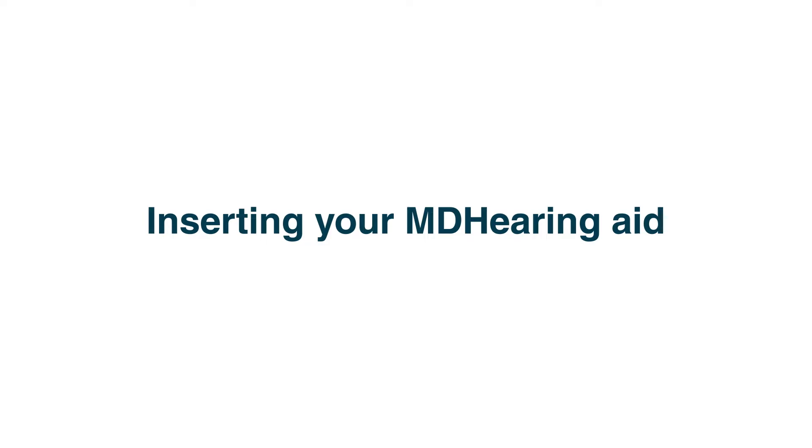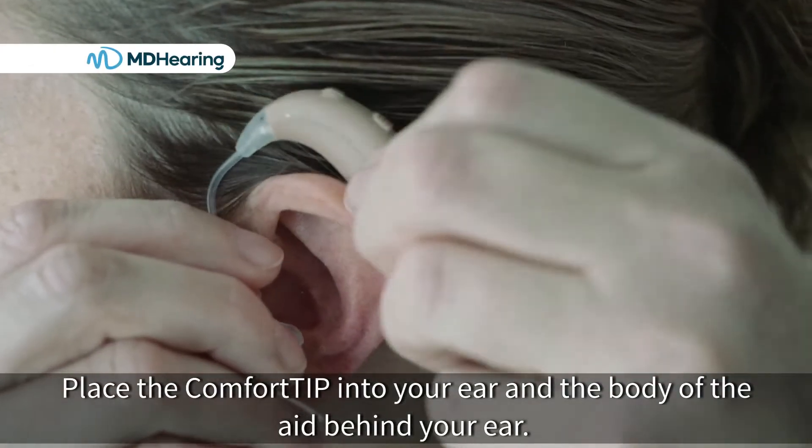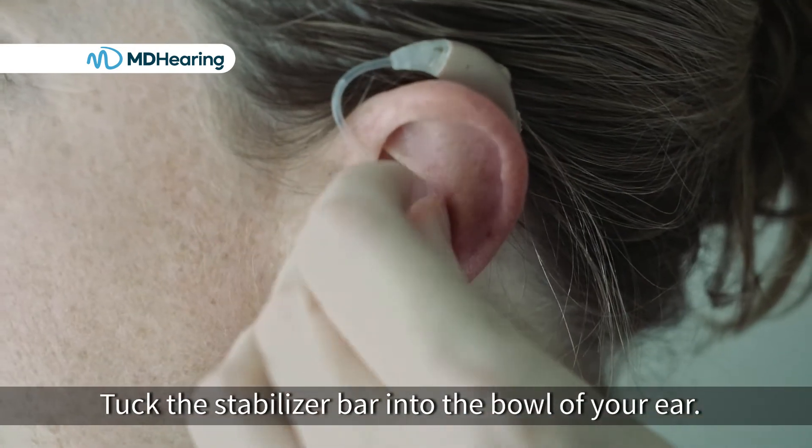Inserting an MD hearing aid. Place the comfort tip into your ear and the body of the aid behind your ear. Tuck the stabilizer bar into the bowl of your ear.